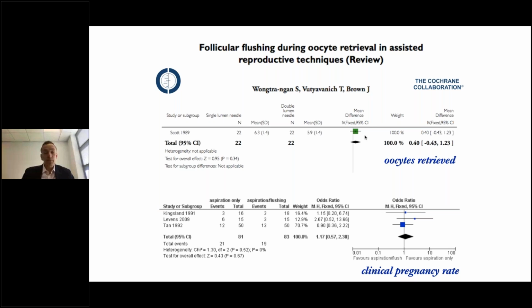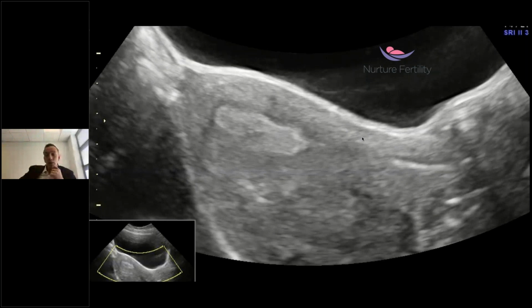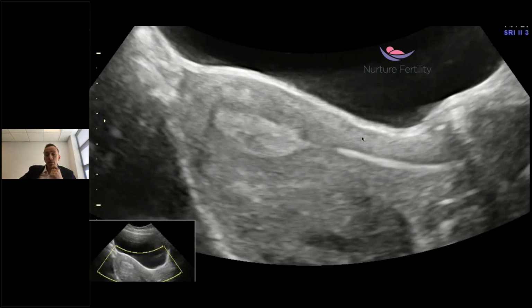And I'll finish on this one, embryo transfer. So I think it's a nice way to finish. It all builds up to getting the embryo and putting it back. Very straightforward. Few studies say ultrasound is not important, it doesn't help. I could not imagine any of my patients not wanting to see this picture.